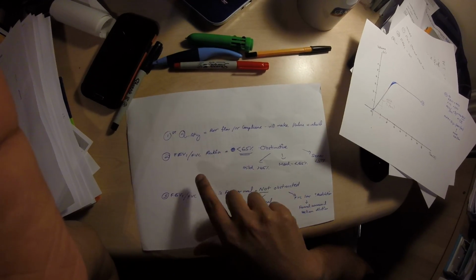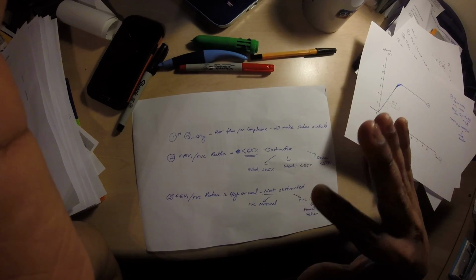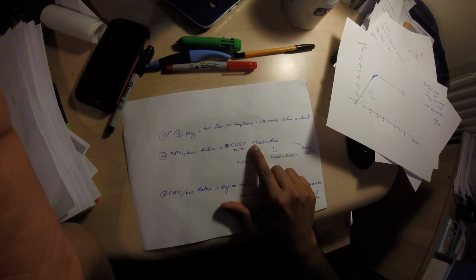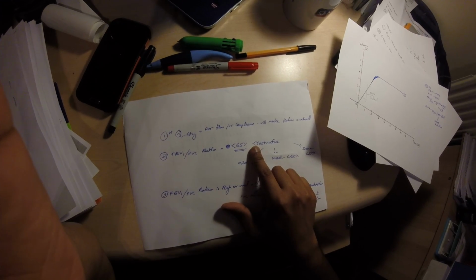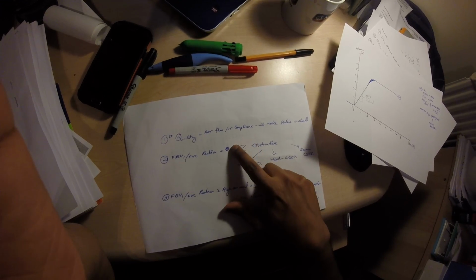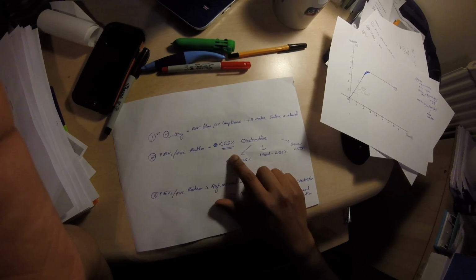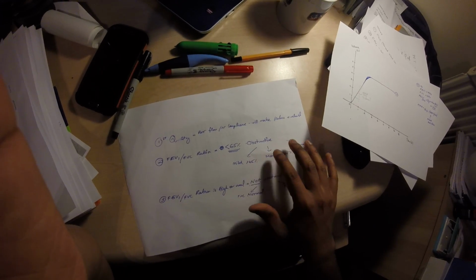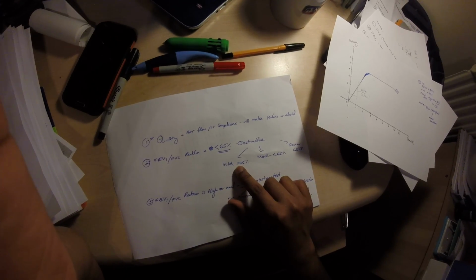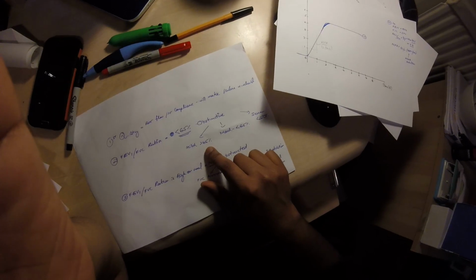That's when we look at when we say it's an obstructive or when we say it's a restrictive picture. An obstructive picture is considered an FEV1 to FVC ratio below 0.65 or 65%. That's divided into 3 categories. If it's more than 65 to 80, it's considered a mild obstructive picture.